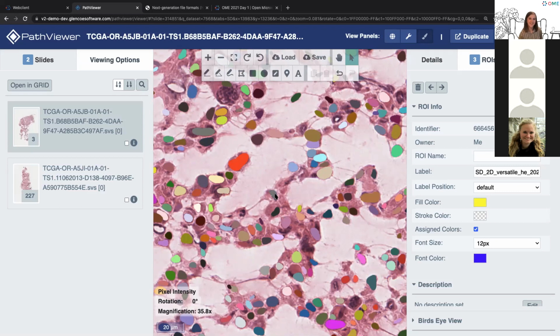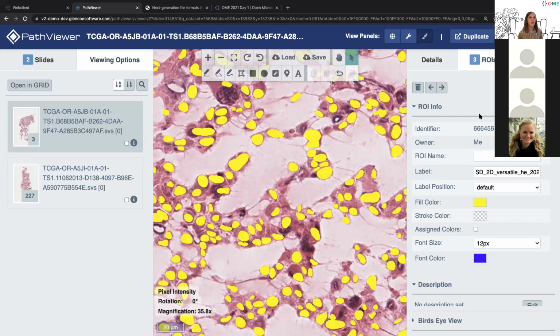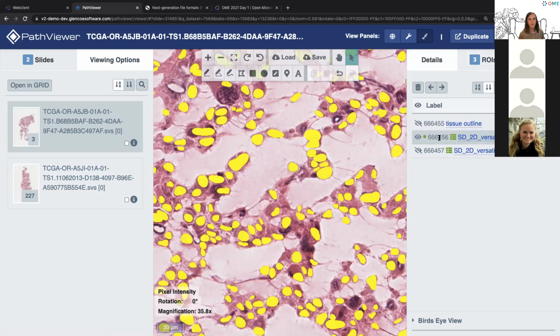Any questions there? So here we see this individual label image, but you might do multiple rounds of segmentation or classification, and you want to represent these together. This brings in the idea that it's important to have resolution of individual objects, but you also want to know that all of these objects came from a particular segmentation run. That's essentially what we've implemented here. I'm going to keep these as all yellow so that we know that they came from this particular segmentation run.